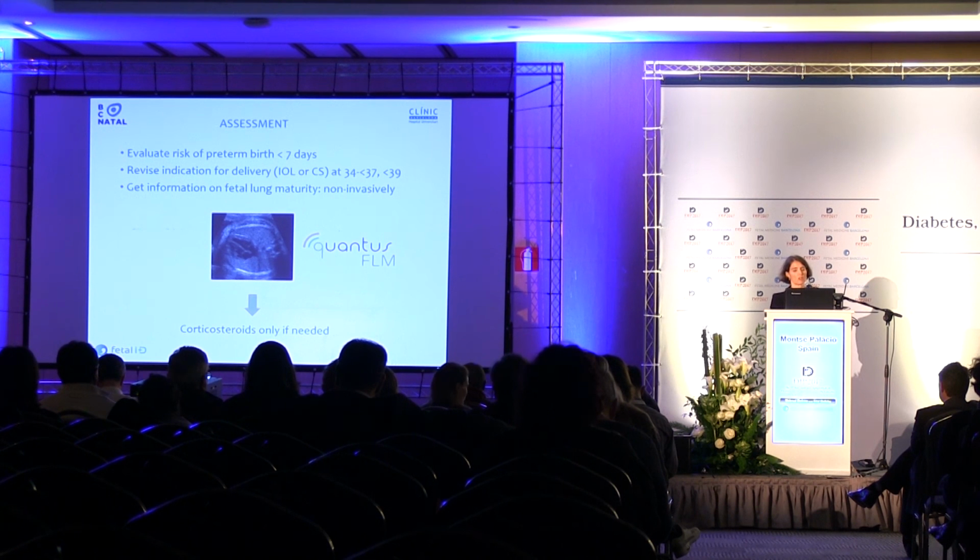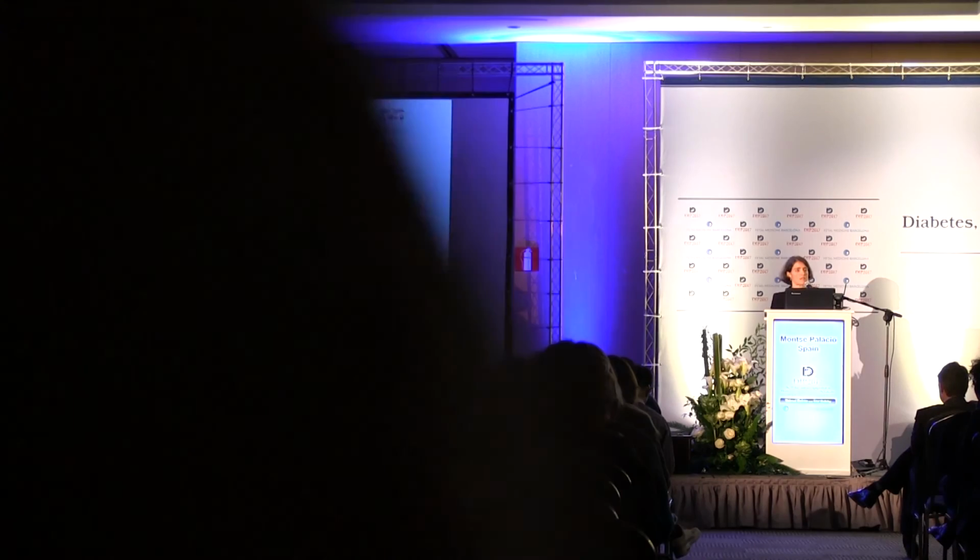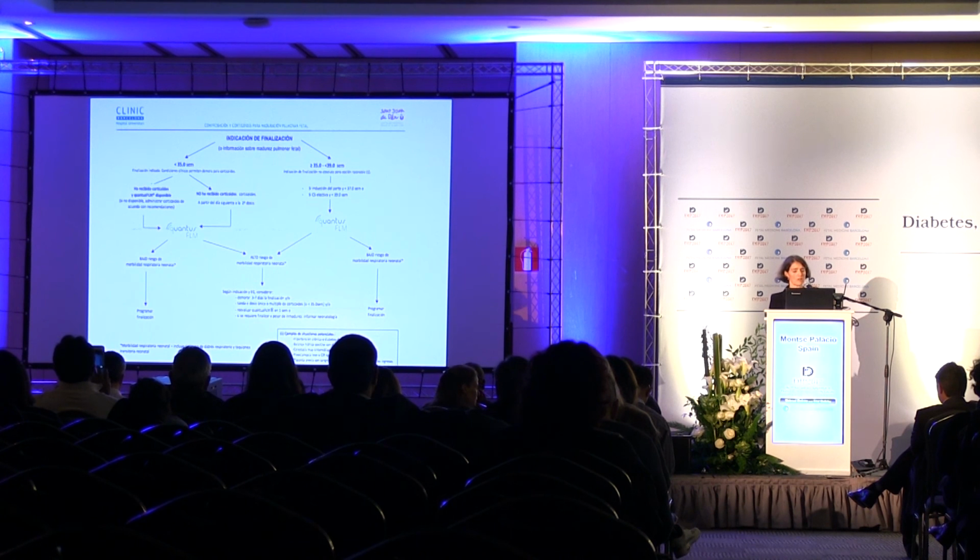But if this baby has to be delivered in any case, we can get information on the fetal lung maturity, and now we know that we can do this non-invasively. You can do a Quantus, and then you can indicate corticosteroids only if needed, so you do not overtreat other patients. You can put all these things in your clinical protocol, which could be adapted to your clinical setting, and get a decision making much more homogeneous, which will be much better for your colleagues and, of course, for the patient.